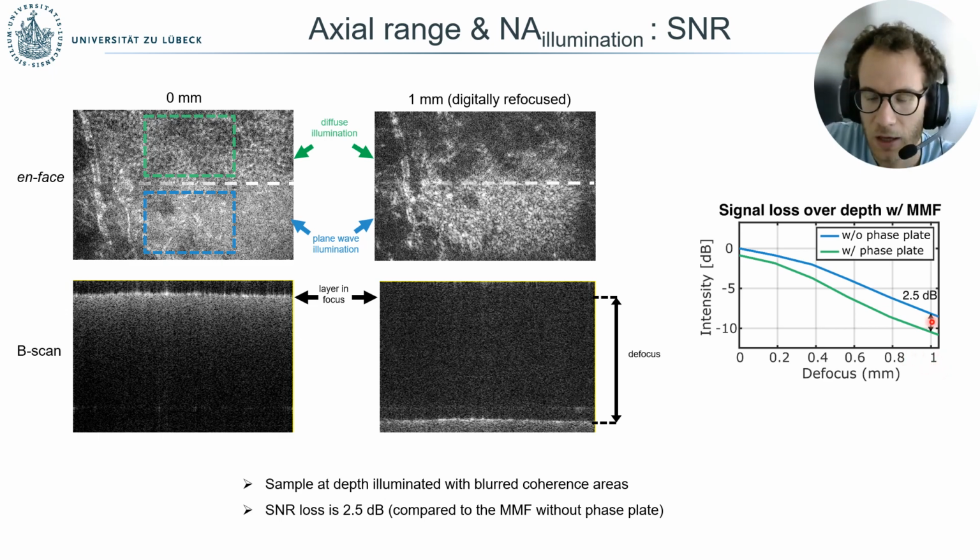So the additional loss of intensity caused by diffusing the illumination compared to non-diffusing the illumination, still with single mode fiber, multi-mode fiber, is largely acceptable.